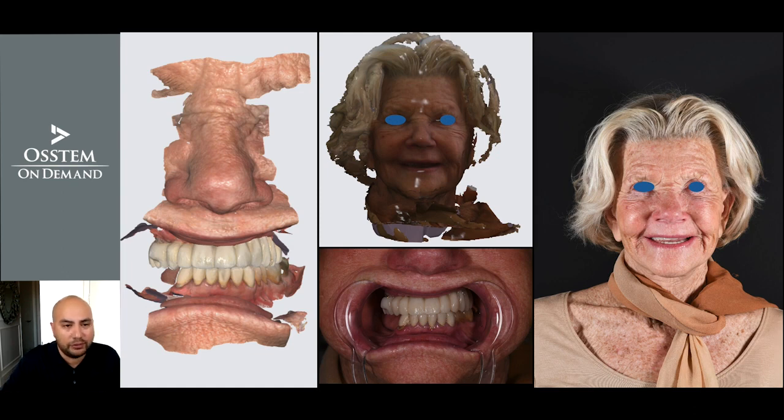The next step is to obtain facial scanning data, which is then merged with the intraoral scanning data. As you can see here, the current interim prosthesis is still not straight, and the midline is not adequate. Moreover, the teeth are not giving enough lip support for the patient.